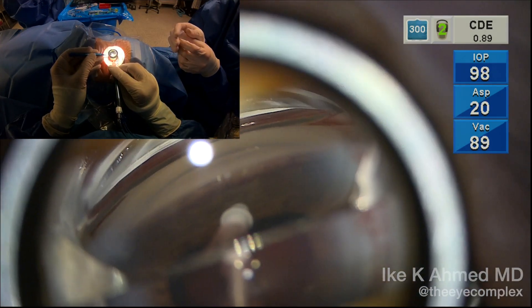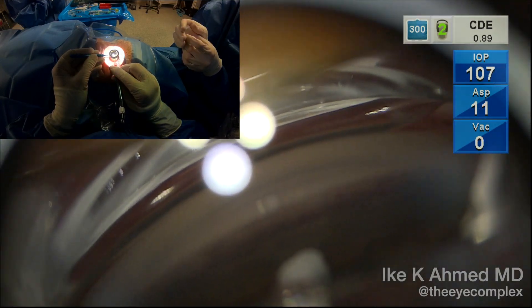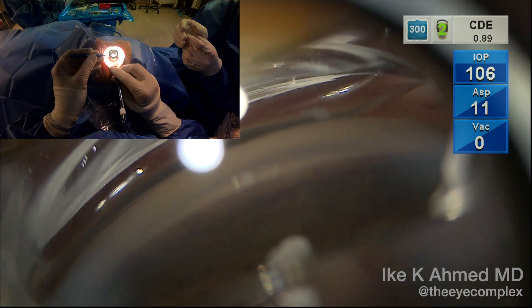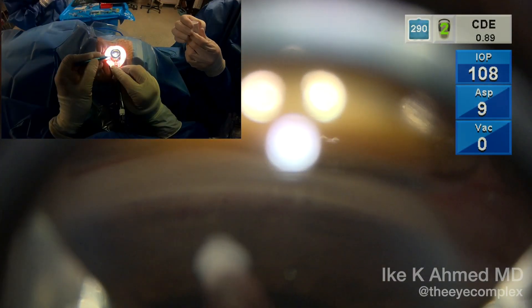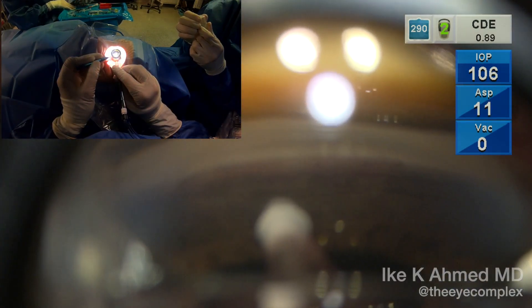At this point, we will look here using a direct view DVX lens, and we can actually nicely see the ostomies. This is doing a view without tilting the microscope, and again just further evidence that we have good placement of these ostomies.